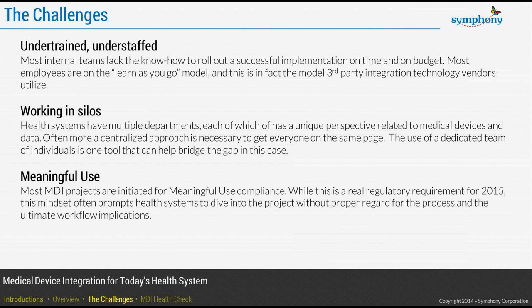Now, meaningful use. This is on everybody's list. Obviously, this is a big deal. It's a regulatory requirement for 2015, and often the mindset is, well, we're going to jump in, we're going to get this done, and since it is included in the EMR section of meaningful use, in other words, when you're talking about meaningful use, the EMR is what drives the MDI implementation.